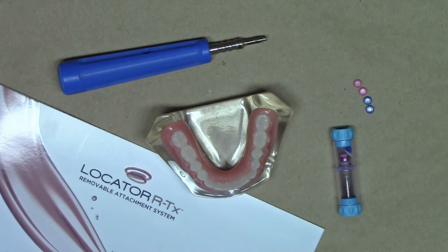Hello, this is Dr. Michael Scheer with LearnLocator, a free resource on how to treatment plan, utilize, and maintain Locator and Locator RTX attachments for overdentures.